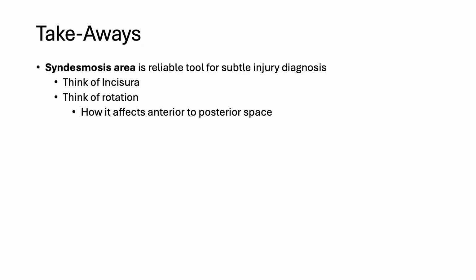I do not want fibular rotation. Even if it's subtle, it can still cause arthritis down the road, and I think these studies on weight-bearing CT scans led me to be way more aggressive on just isolated fibular fractures, and I also am just really aggressive on fixing the syndesmosis on them.